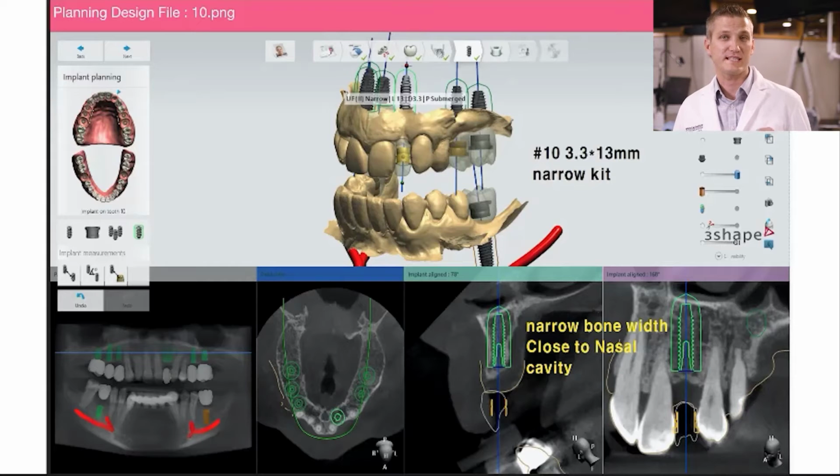So right here, you're seeing exactly a screenshot of what was in my DO Navi portal that shows the planning from our laboratory. You're seeing a prosthetic tooth being planned, and then the implant being positioned relative to the osseous structures, and of course the prosthetic tooth. You can see our implant has at least 1.5 millimeters of bone around the buccal, around the lingual. We have about 1 millimeter or so before the floor of the nose, and then you see the angle of our implant fits nicely relative to the shell of our prosthetic number 10.